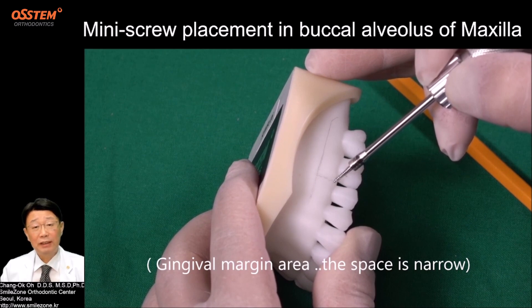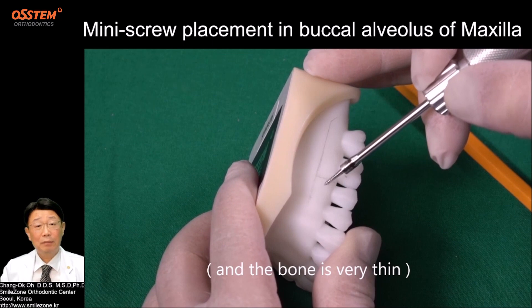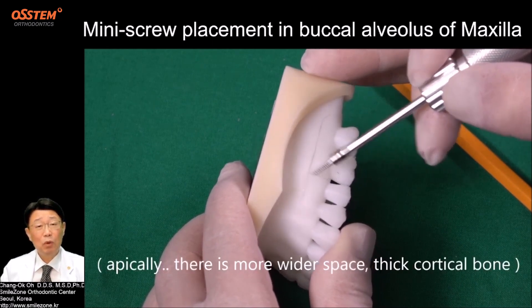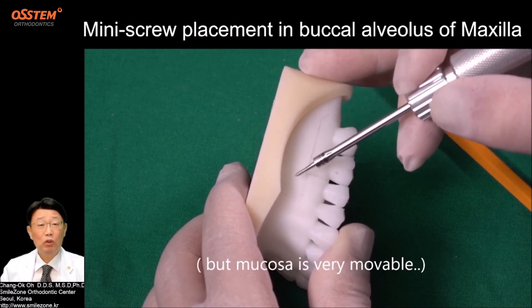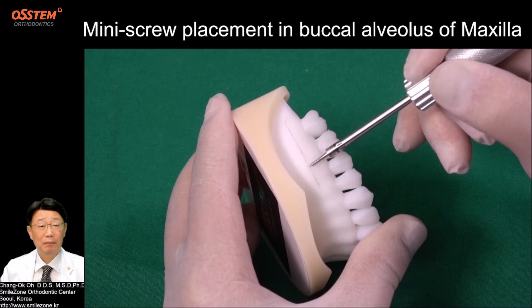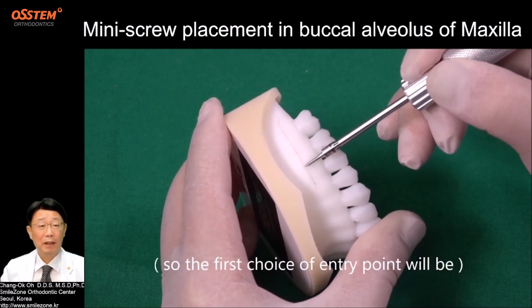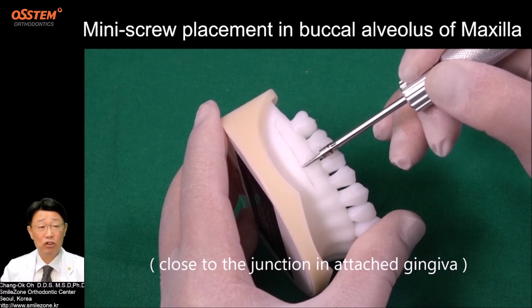At the gingival margin area, the space is narrow and the bone is very thin. Apically, there is more wide space and thick cortical bone, but the mucosa is very movable, which is not good for stability of the screw. So the first choice of entry point will be close to the junction in attached gingiva.